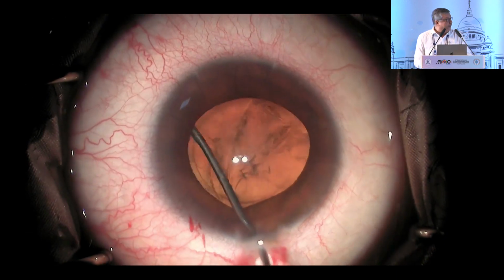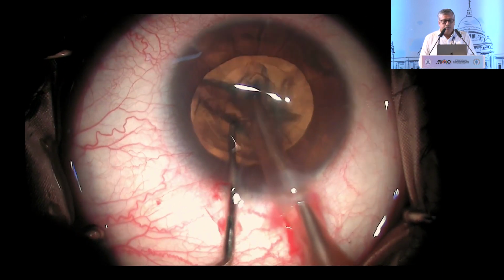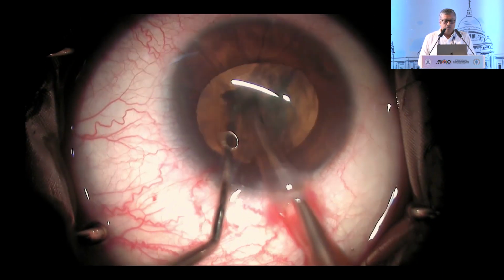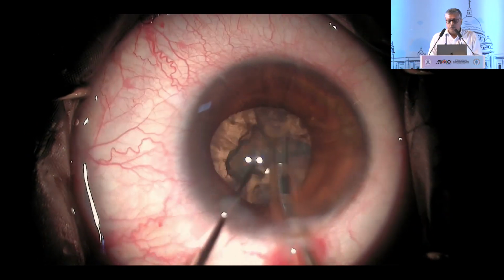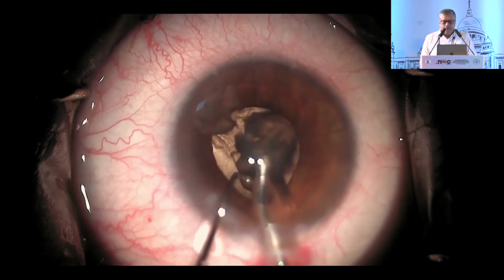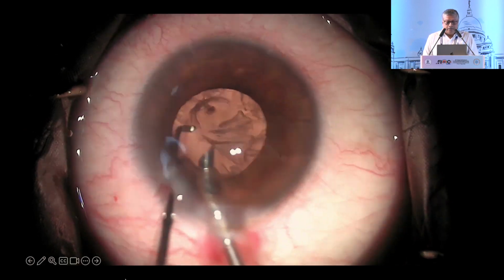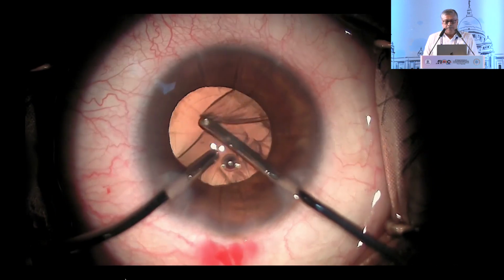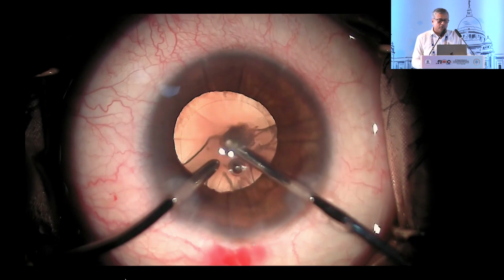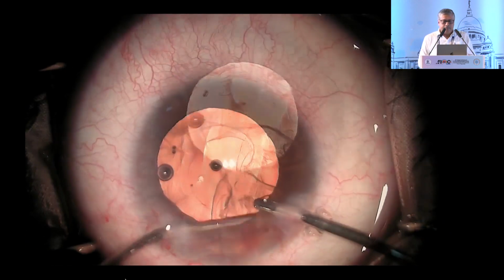The rhexis has to be adequate so as to overlap the lens, because that's very important. Otherwise, you might develop PCO later on. And as you know that in myopic patients, if you do a YAG capsulotomy, the chances of RD increases manifold. So at every point of time, you have to respect the anterior chamber depth. So while coming out, you must inject viscoelastic so as not to create any kind of posterior vitreous detachment.